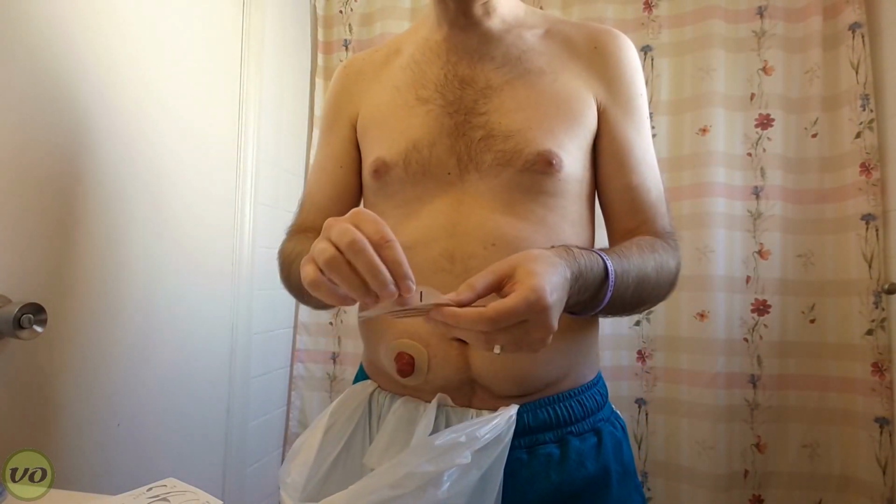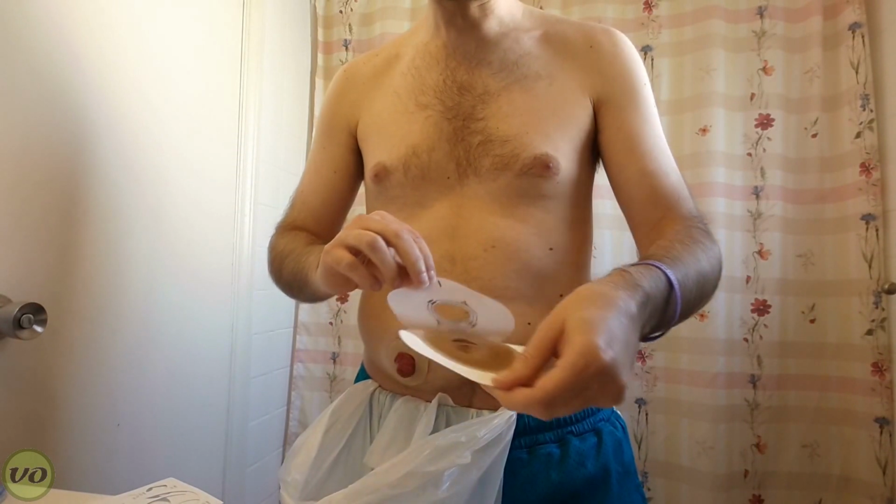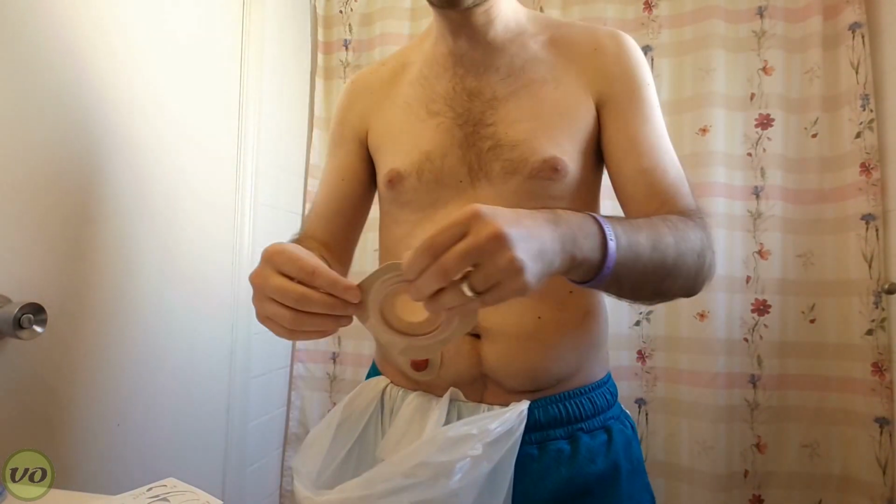So I'm going to go ahead and peel this, again making note of where my top is.